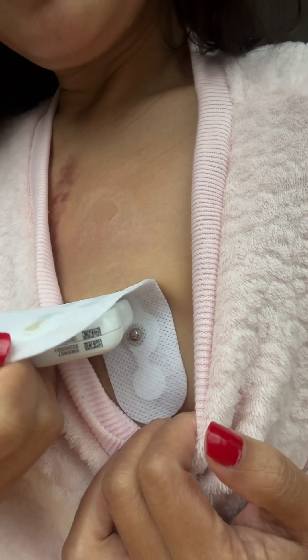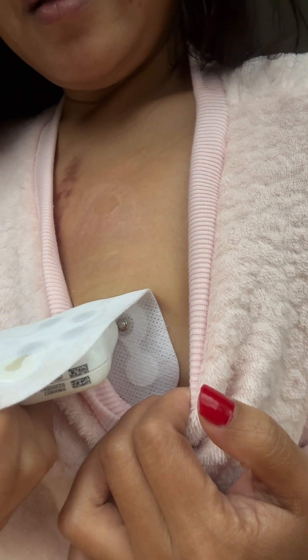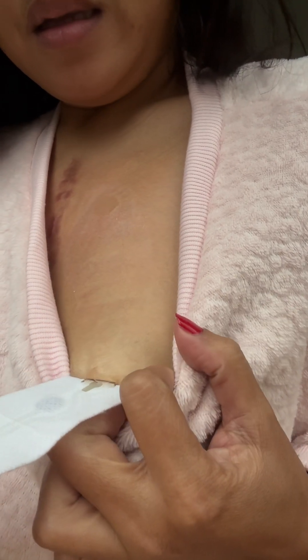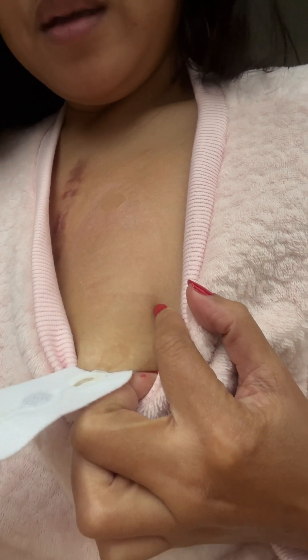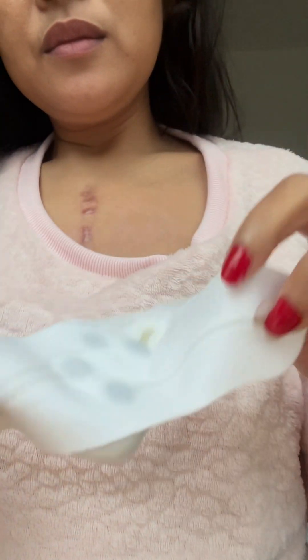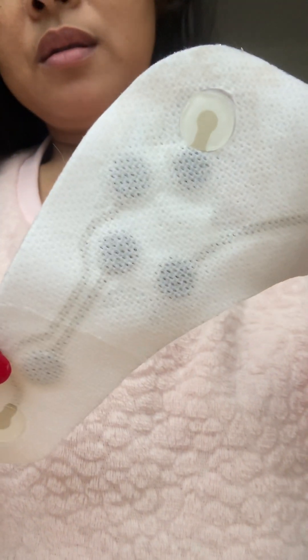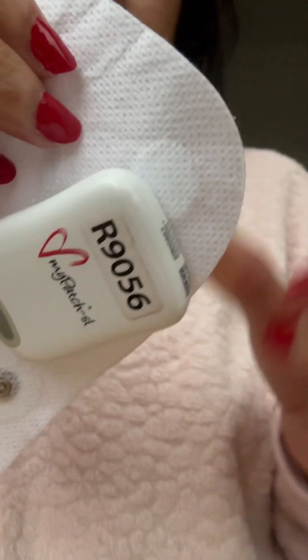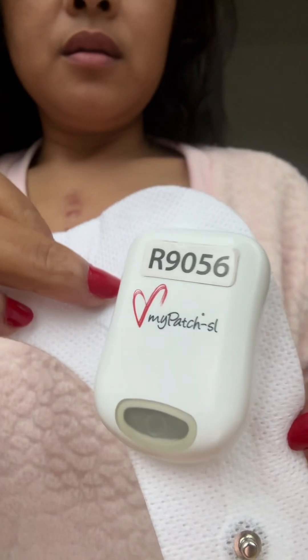I've had this already for four days, and from what I know, you can have this for up to 14 days. I'm taking it off slowly because it will irritate my skin. As you can see, this is how it looks on the back side of the Holter Monitor.